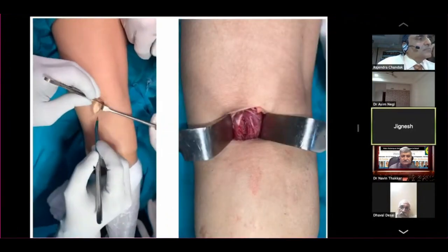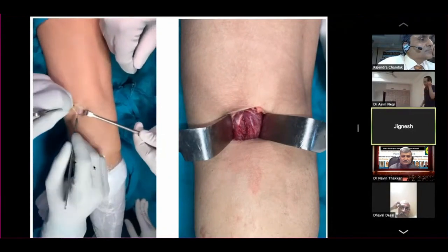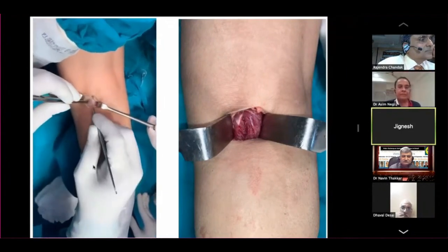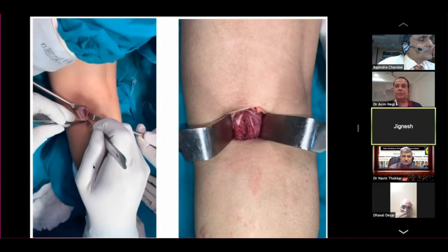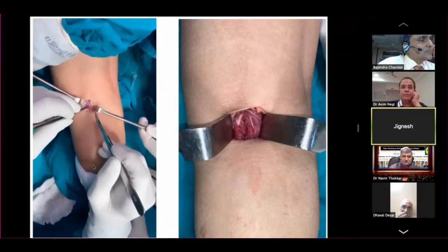Now the fascia is retracted. We can see the muscle covering the fascia. Two retractors are placed after cutting skin and subcutaneous tissue. Now I am going along the line of fibers of the gastrocnemius medial head. I will release just the fascia and not the muscle — no muscle cut. So it is done.